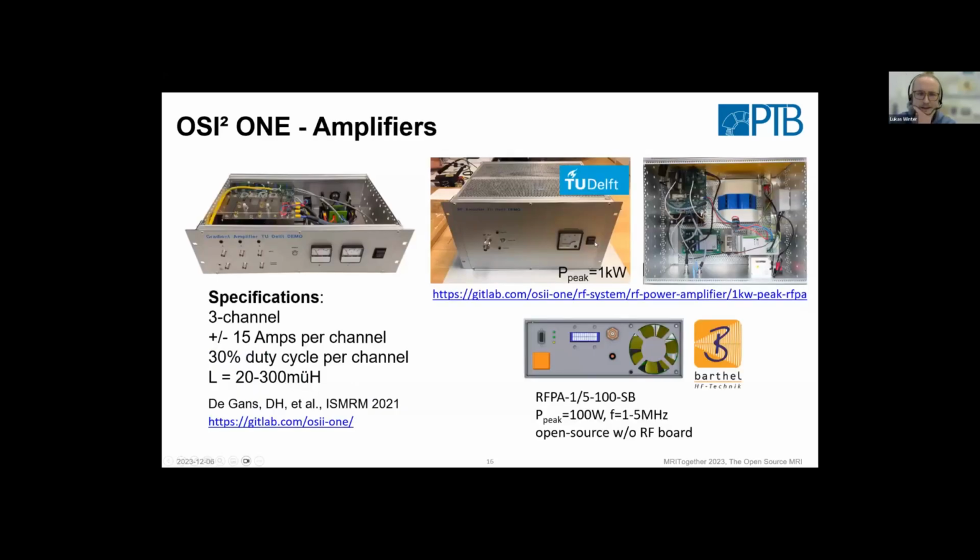Okay, electronics, or in particular more amplifiers. So the gradient amplifier that Tom showed, this is great. We will use that. There will be just tiny modifications made, but in principle, the design will be used as is. The power amplifier, yeah, it's a little bit too overpowered. And probably the most annoying part about it is that it's too loud in its current configuration due to the thermal management that's been done at the moment. So this will be worked on. So there will be a lighter version of that.